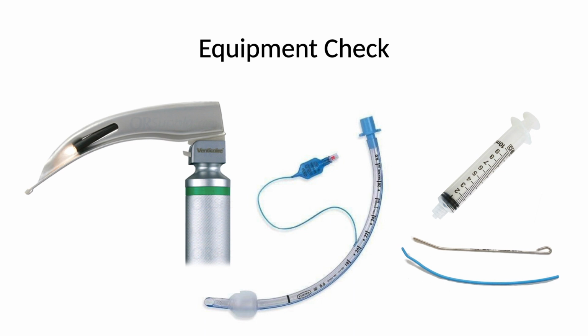Truly, the airways that we're managing in the pre-hospital setting are some of the most complicated that you'll ever see. And anything that you can do to set yourself up for success on your first pass, I would encourage you to do. And so try to get used to working with a bougie. Study after study has shown that if you train with a bougie, it helps in the most difficult airways to get you in the right place to place your ET tube.